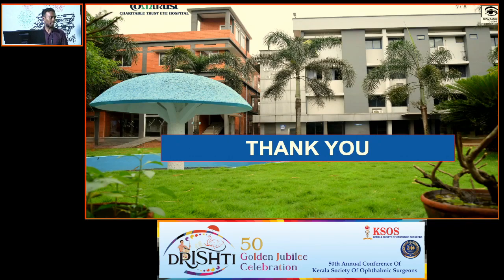Thank you. Very nicely explained, Dr. Dilesh. Thank you for the very nice talk. Nowadays, most of us are doing pre-op OCT, especially for premium IOLs, because post-op surprises are really difficult to counsel later on. And for patients with vision loss out of proportion to cataract, it's better to do an OCT to see whether there is any problem sitting in the macula, because this can create problems later after cataract surgery. Thank you.